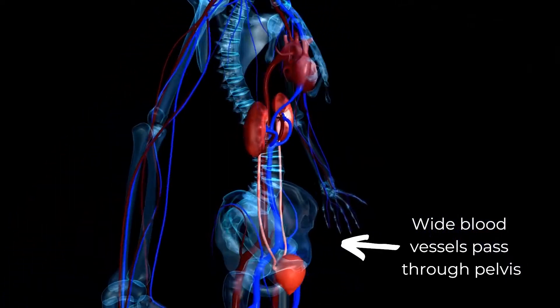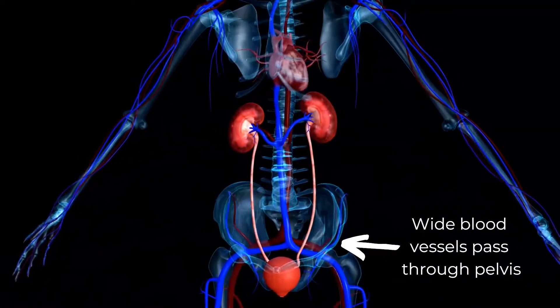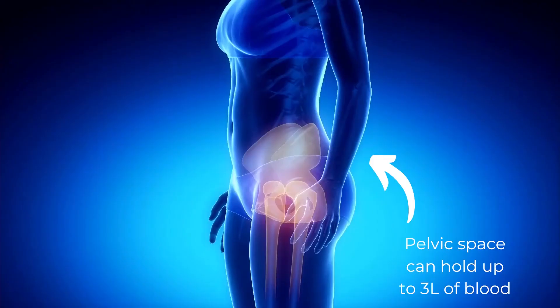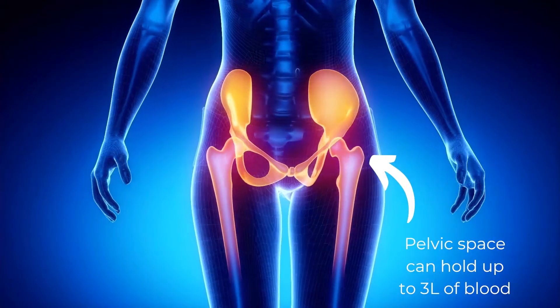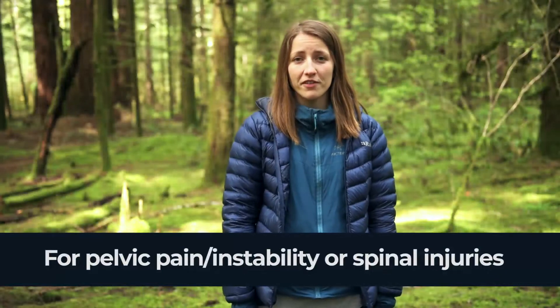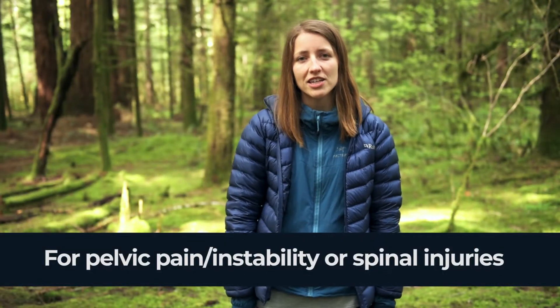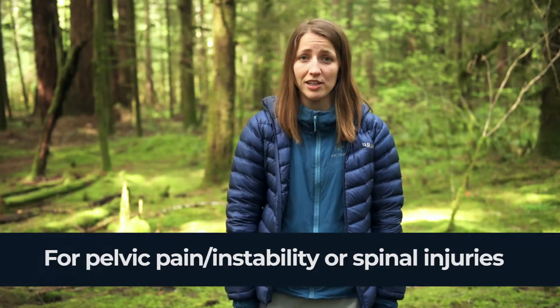If a patient has had a suspected pelvic trauma, then they are at risk of losing a lot of blood. There are many blood vessels in the pelvic area, and if any of these are damaged, several liters of blood could leak into the pelvic space. Putting on a pelvic wrap is simple and quick. You should use one any time your patient has any pelvic pain or instability, and in any suspected spinal injury.